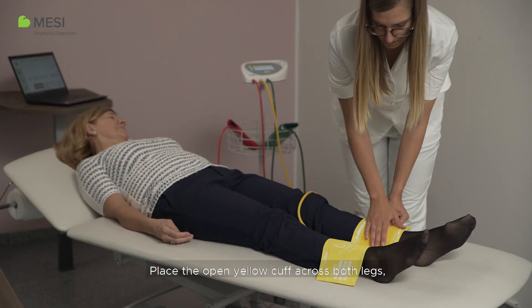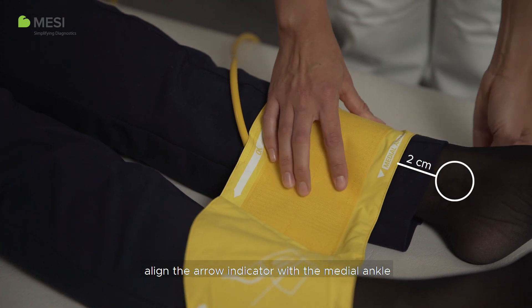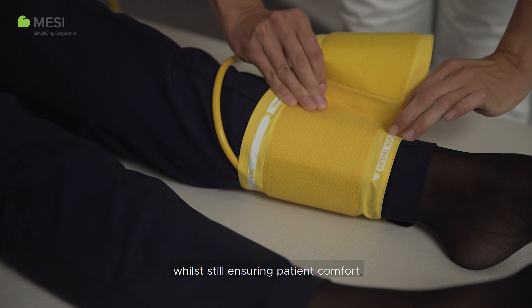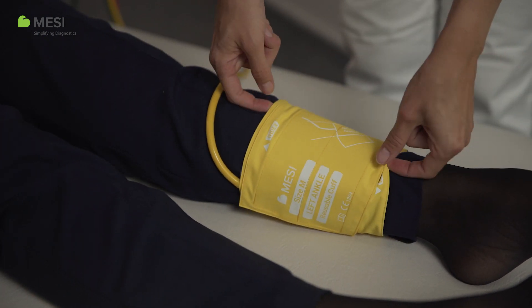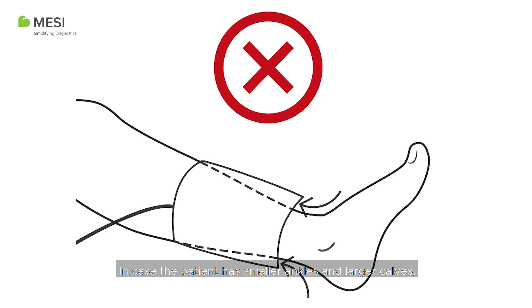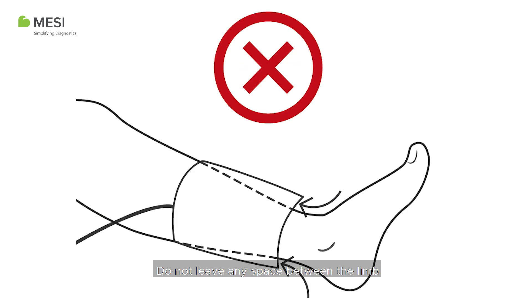Place the open yellow cuff across both legs, align the arrow indicator with the medial ankle, and wrap the cuff around the leg tightly whilst still ensuring patient comfort. In case the patient has smaller ankles and larger calves, make sure you place the cuffs so they follow the leg shape as demonstrated. Do not leave any space between the limb and the cuff.